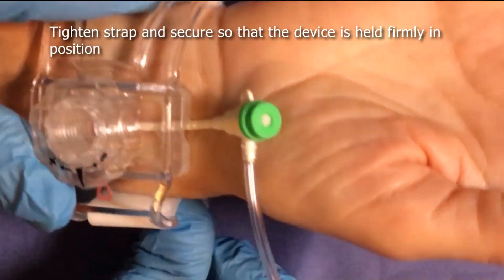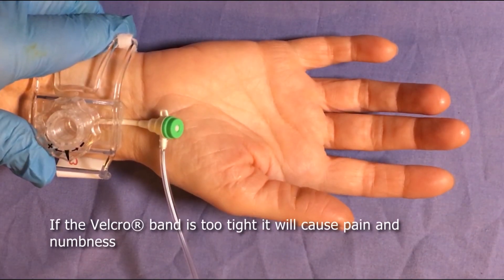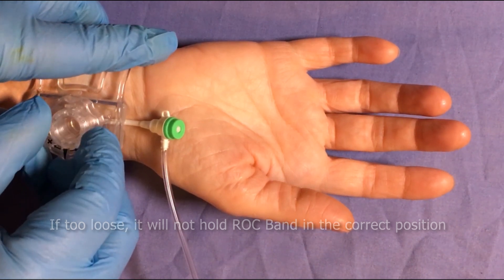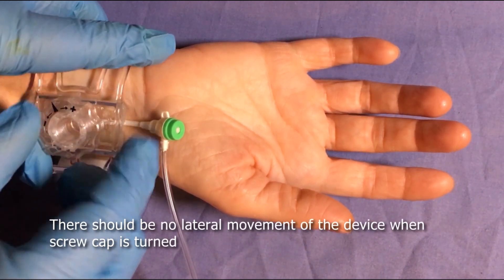Tighten and secure the strap so that the device is held firmly in position. If the band is too tight, it may cause discomfort for the patient. If the band is too loose, it may not hold in the correct position. The device should be secured with no lateral movement when turning the screw cap.